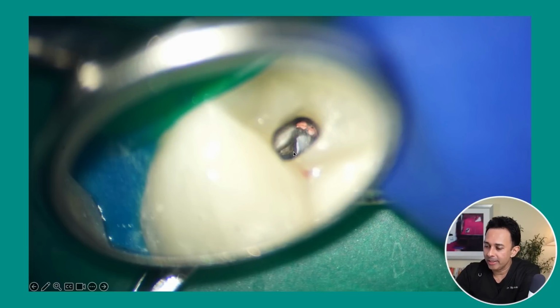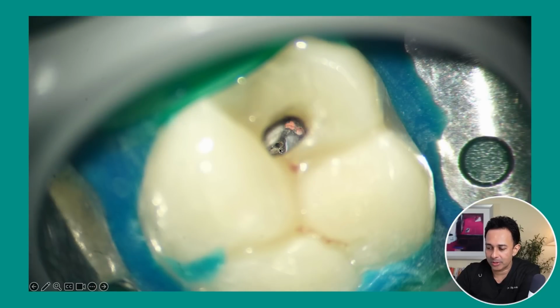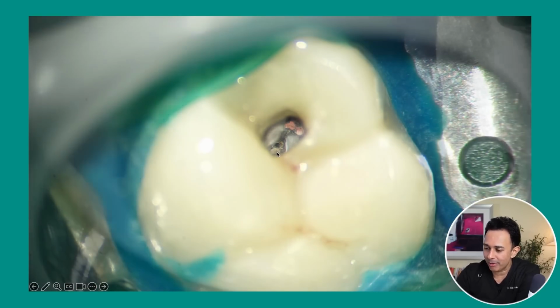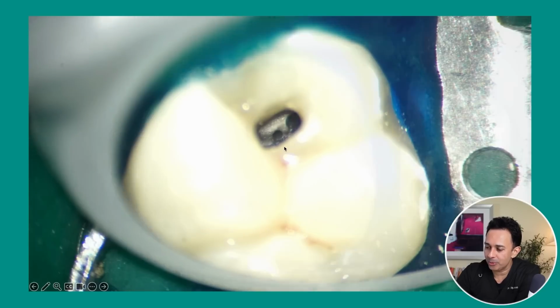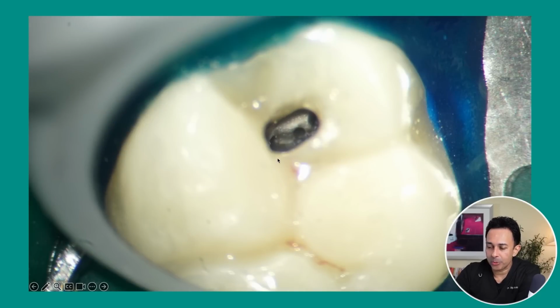So that's what we did. So you can see here, really clear. And I look for the MB2 along this line, and that's where I found this. So that's the MB2. This is the MB1. And in this particular case, I even found an MB3. So MB1, MB2, and then that's the MB3 over there.